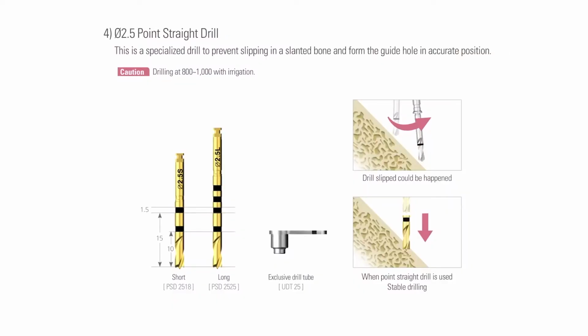Drilling against cortical bone, as we do, for instance, on post-extraction implants, can lower the predictability of the surgery because our drill tends to take the path of least resistance and slide off the dense bone. DIO Navi team has addressed this problem with the introduction of their special kit, where one can find special burrs designed to perform an osteotomy on dense steep bone.